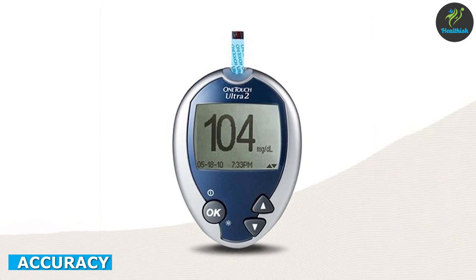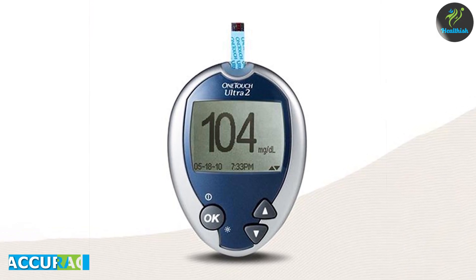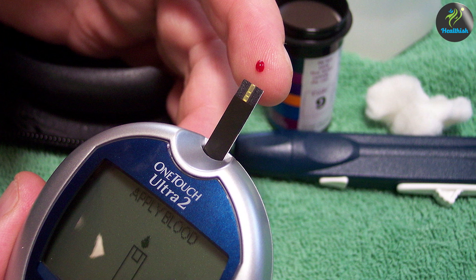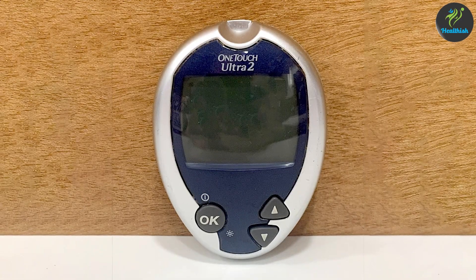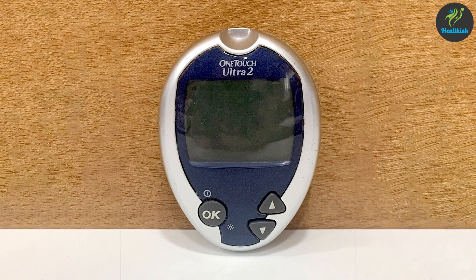Accuracy is crucial when it comes to blood glucose monitoring, and the OneTouch Ultra 2 aims to deliver reliable results. The meter utilizes the OneTouch Ultra test strips, which are known for their accuracy. However, it's important to follow proper testing techniques and ensure that the test strips are not expired or damaged to maintain accuracy.